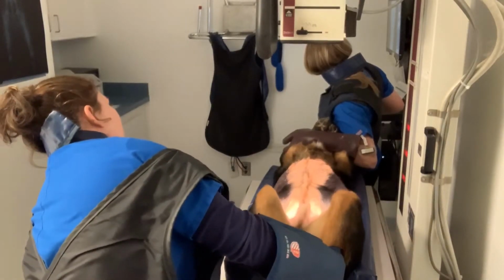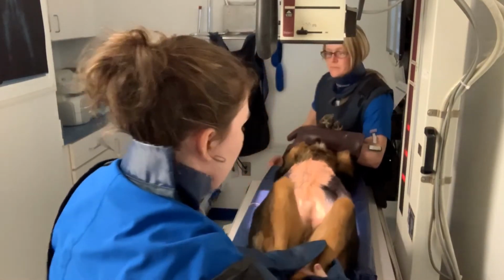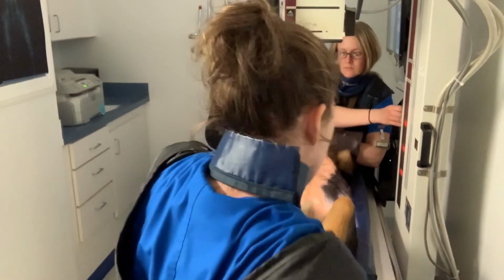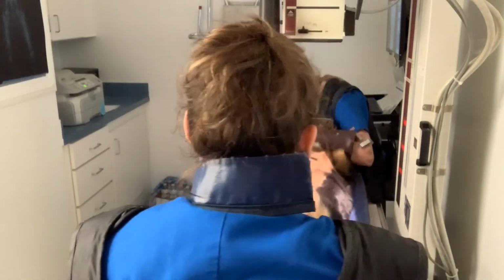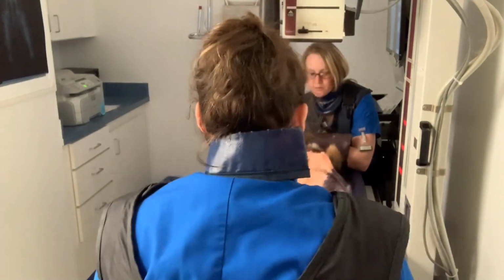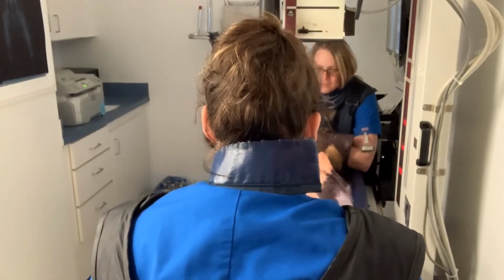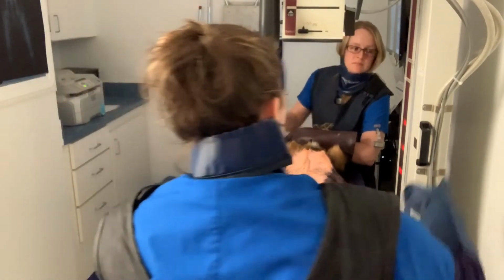If possible, avoid parasympatholytic agents and drugs used for treatment in GI disorders, which may cause gaseous distension or decrease motility prior to the contrast study. Use of anticholinergics should be suspended at least 24 hours, though preferably 48 to 72 hours, prior to administration of contrast media.